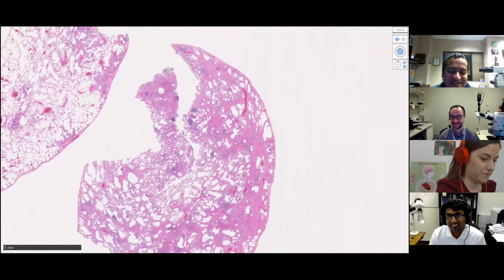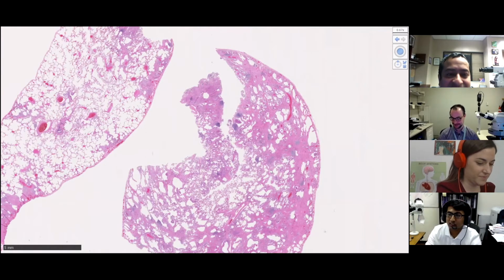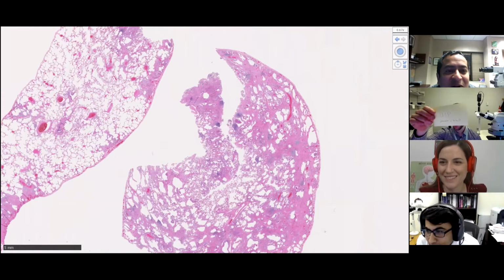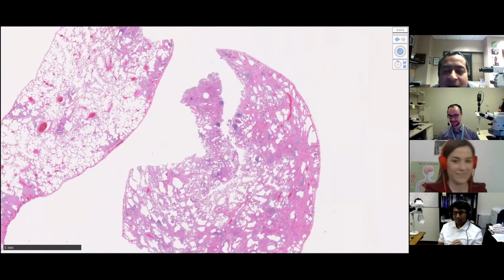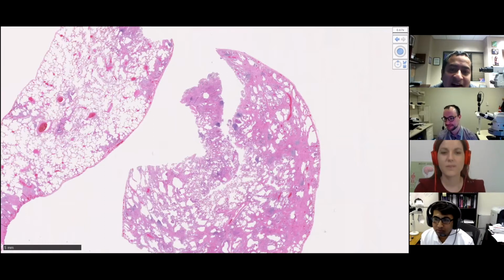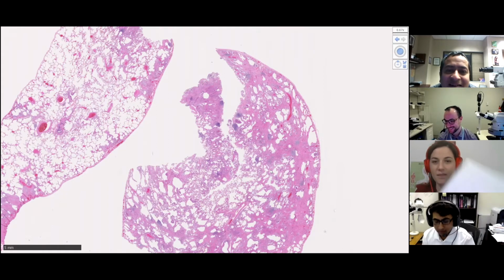Okay, who's going first? Since this is my idea, I'll go first. Okay, let's see your thing, man. Hold it up to the camera. So I said UIP with possible CTD-ILD. Connective tissue disease related ILD. Okay. UIP, CTD-ILD. Nice. Irene? The same.